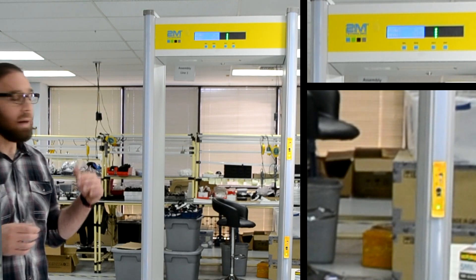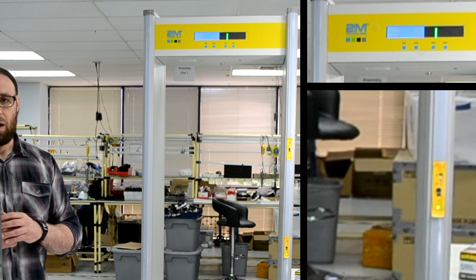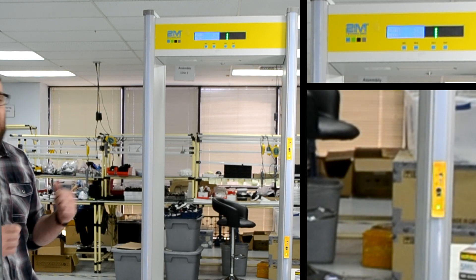Now we're going to demo the metal detector part of the machine. We're going to have Anna pass through it with some kind of metal on her. Any area that has the metal part is going to light up in red.